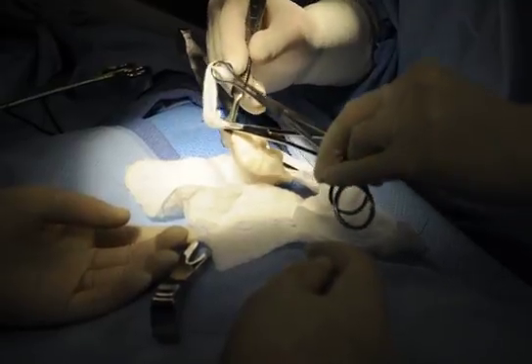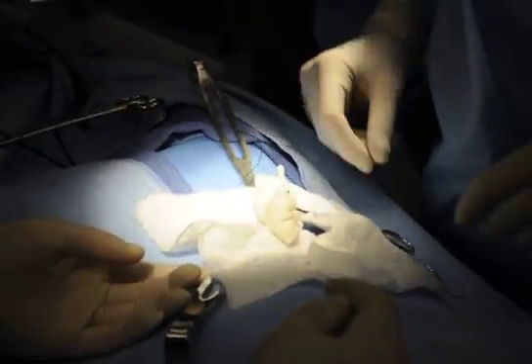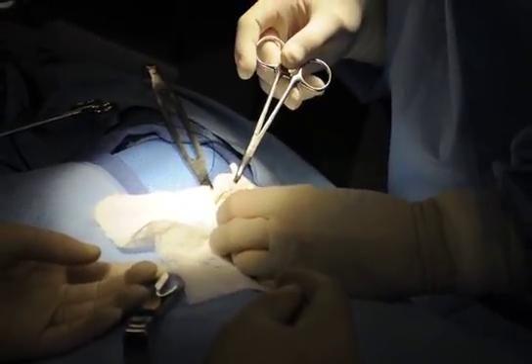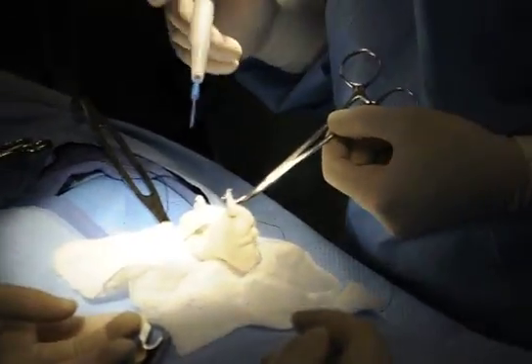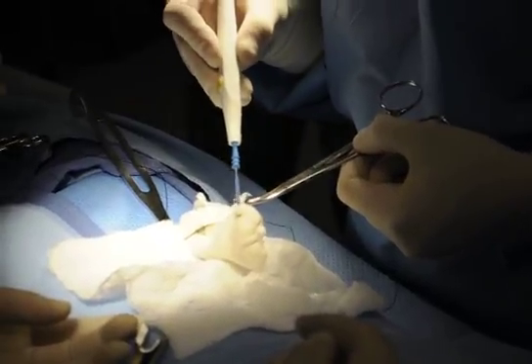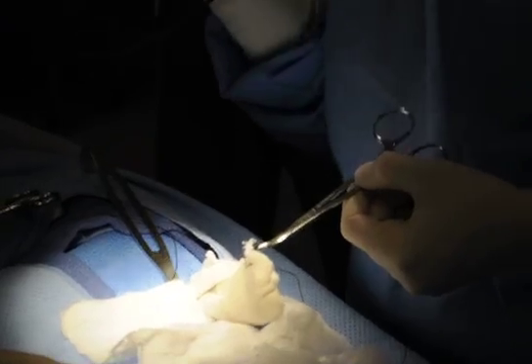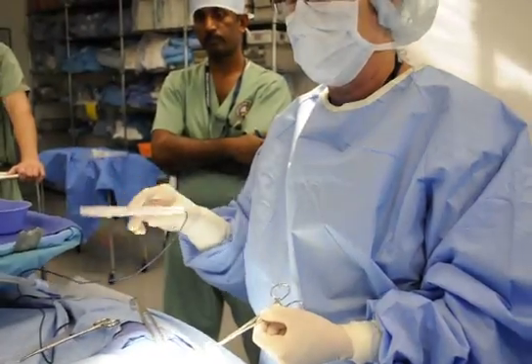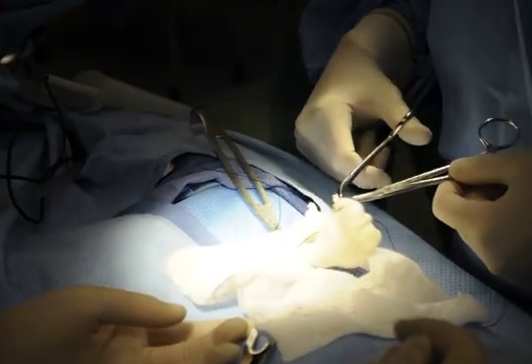See, now I need a straight clamp to cut against — that's why you use a straight rather than a curved clamp first. Now, do we still have a dirty clamp up here? Is this on the stump of the appendix? Yes. So now they can also do this if they want to — buzz the stump with the bovie. I've always been told the heat kills any bacteria that would be on there.